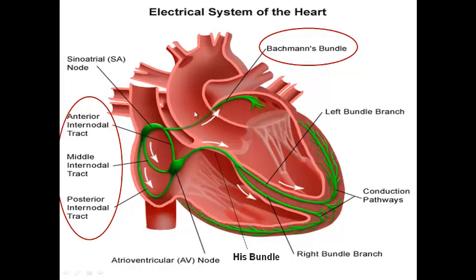and that's the reason that the right atrium and left atrium are depolarized. To be accurate, the left atrium is slightly depolarized after the right atrium, but in the ECG we will see the atrial depolarization, which represents simultaneous depolarization of the right and left atrium, even if the left atrium is slightly delayed after the right atrium.